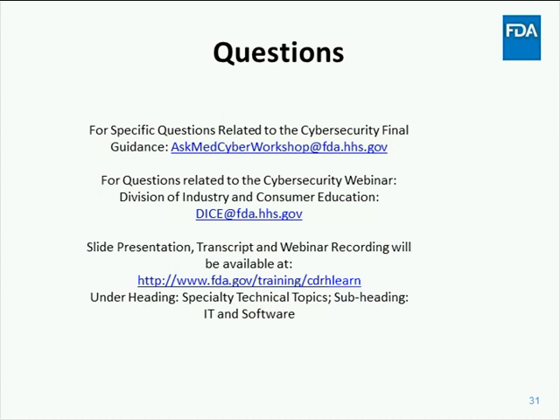This is Seth Carmody. Yes, excellent question. We fully recognize that in the scope of 60601, they specifically exclude IVDs, but we're applying the concept to IVDs. So we're not excluding IVDs from the scope. Remember that safety and essential performance, again, is the key to including manufacturers in the risk, the clinical risks that can manifest from the exploitation of vulnerabilities.